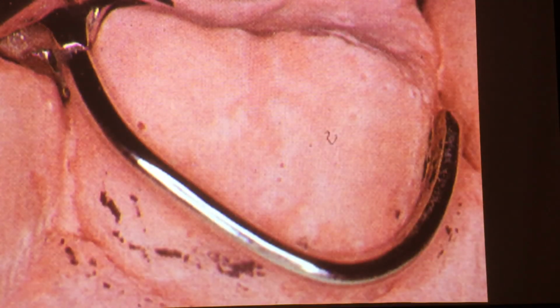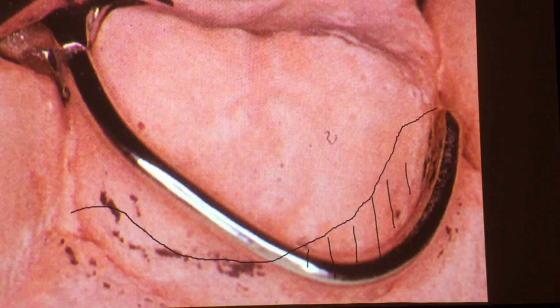So here we have a retentive arm. It looks like a wrought wire retentive arm cast into a chromium cobalt. But regardless, if I could superimpose, and let me change this to a black one so we can use the right color, for goodness sake. So if I was to go over with my height of contour, you can see it was kind of rubbed off here. It was probably something like this, the height of contour, in the black line that I've drawn. Hopefully you can see that. So this wrought wire clasp is engaging below the height of contour in these blacked out hash mark areas. This is the active part of the arm. This is part of the retentive arm that flexes, open, closed. Path of insertion, it flexes open. Path of dislodging, it flexes open and releases itself from the bulge of the distal of that molar.